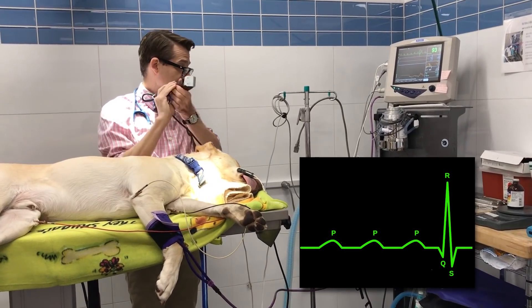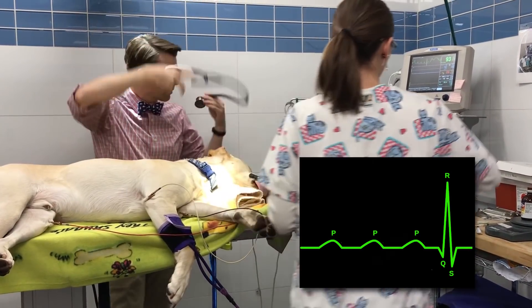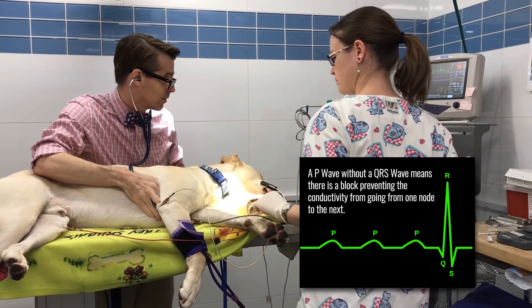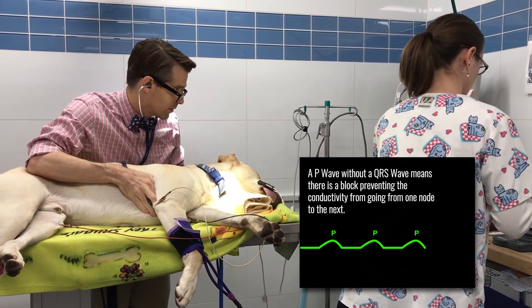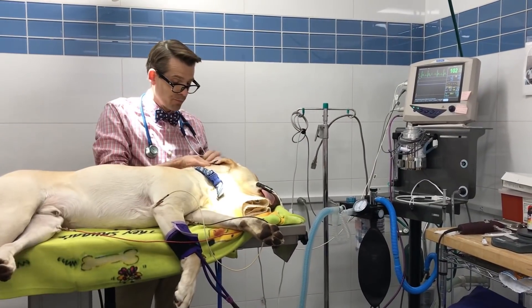This is a P wave, P wave, P wave, QRS. The heart rate is pretty good — 93 — I'm okay with that. Except if you look at this, this is not a normal strip at all. What I'm seeing is all of these P waves and no QRS waves. That's what we would call heart block. Again, something that can happen, but I don't like it. That's when I tell Jessie: reverse this dog, let's get this procedure done and get it taken care of.